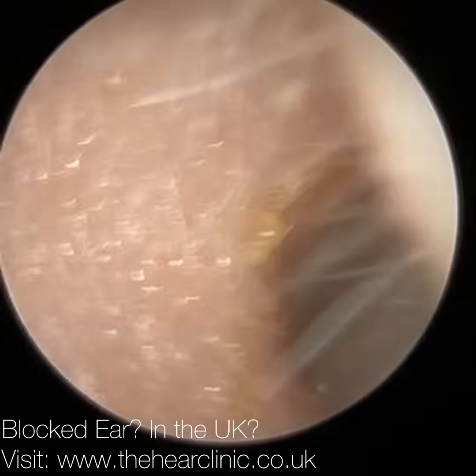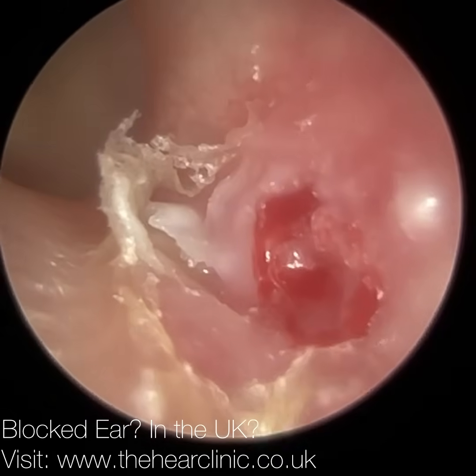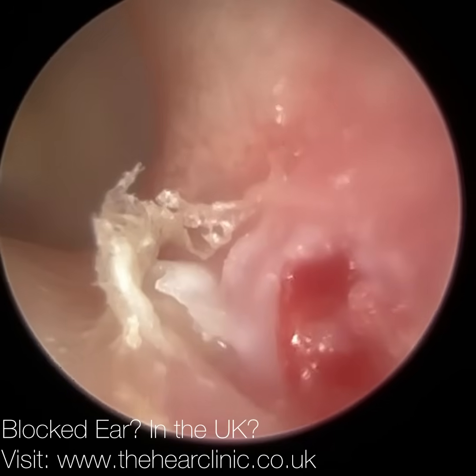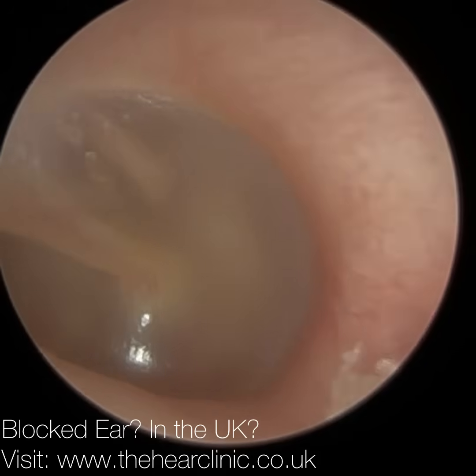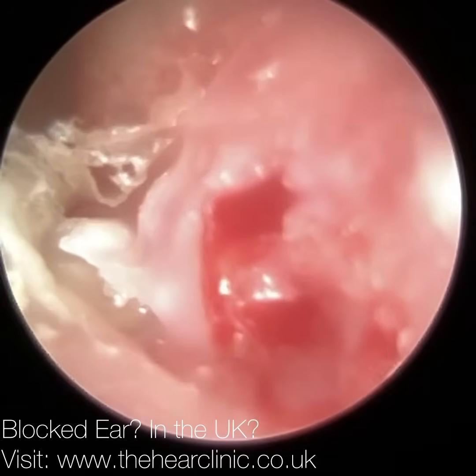This follows on from yesterday's video where I had patients with some erosions. So in the mid part of the bony part of the ear canal — we call this the pars media on the inferior canal wall — you can see there's an erosion here. There is some dead skin but there's inflamed tissue, vascularization, some granulation tissue, and some inflammatory tissue.